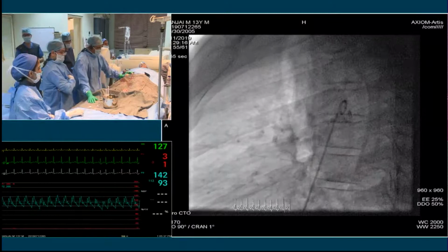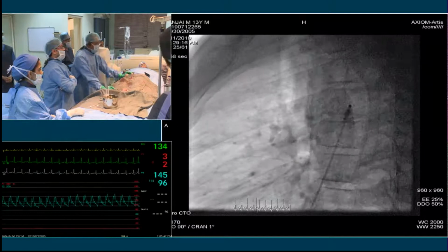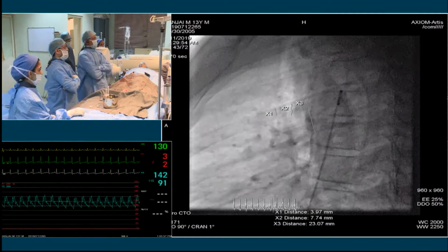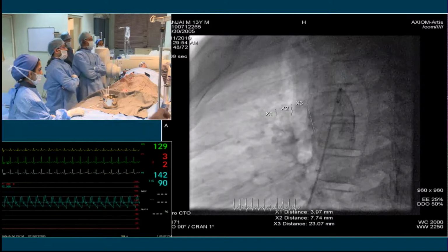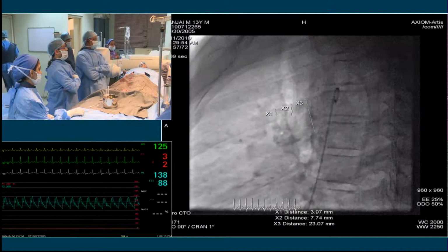So you saw the patient's details. Before you started, we just did the angiogram. So we are going to show the angiogram and the measurement. Yeah, run it. Sorry for some poor quality angio. See, in this angiogram, the measurement on the pulmonary end comes to about 3.8. Of course, roomy ampulla.